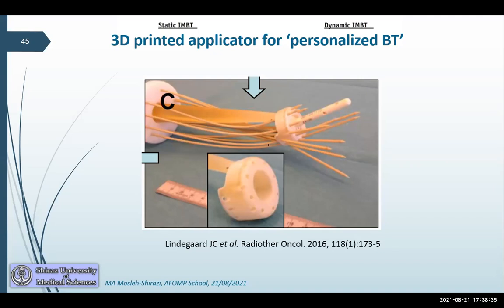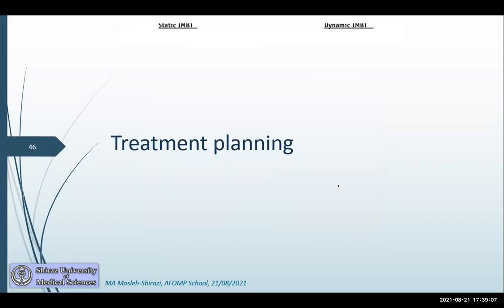3D printing, we've all heard of it. It's come to the help of something called personalized brachytherapy. In several aspects, this is one that I'm showing based on imaging. You design the paths that you would like these needles to go through, and then it goes and actually builds and fabricates these needles, and you insert them as before. So these are 3D printed personalized applicators. Right, let's go to treatment planning.